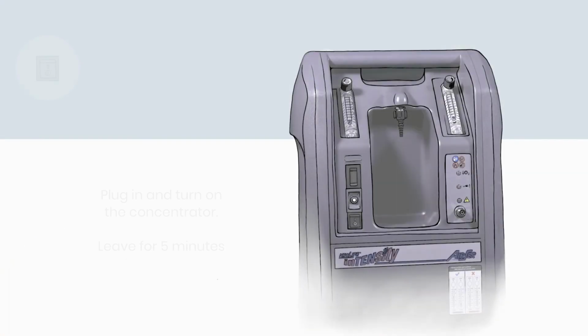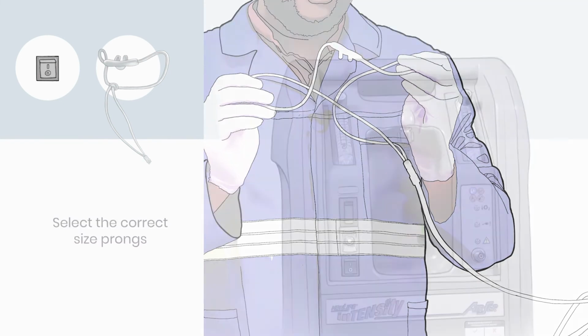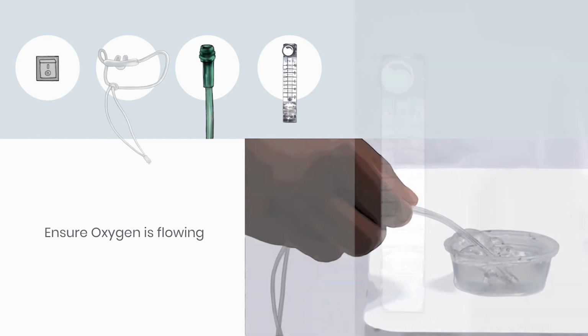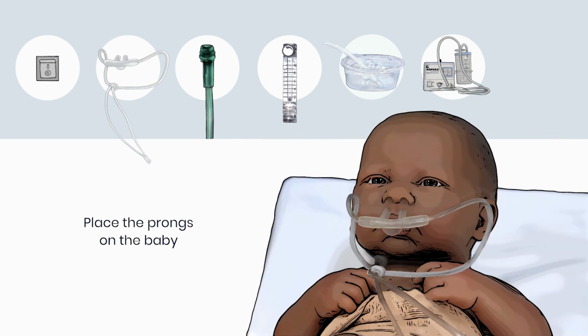So let's see that all again. First, turn on the concentrator and leave it for 5 minutes. Select the correct size prongs. They should fill 70% of the nostrils. Plug the cannula into the port. Set the prescribed flow rate. Check the oxygen is flowing. Suction if needed. And place the prongs onto the baby.